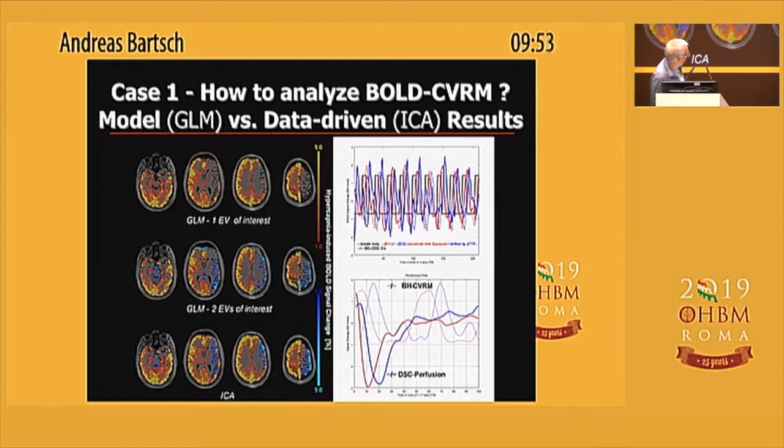It's exactly these 11 seconds that you have from the perfusion. So two different modalities, one with contrast agent and the other under breath hold, show exactly the same thing, that you have a delay in the perfusion in the left hemisphere. And the conclusion was no surgery.